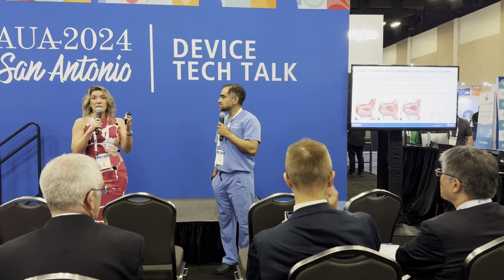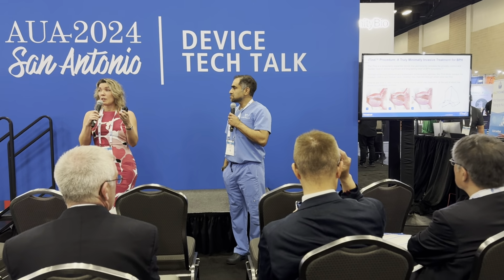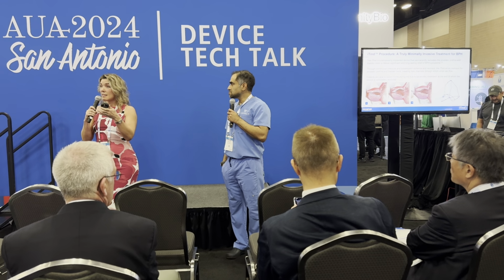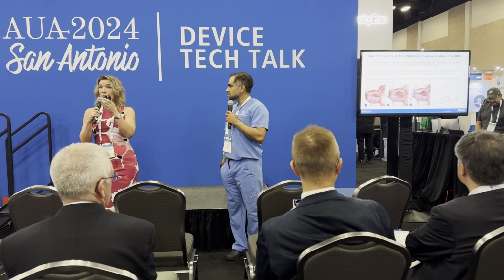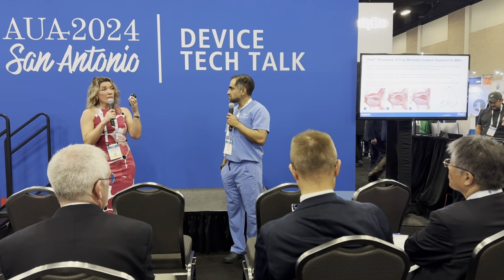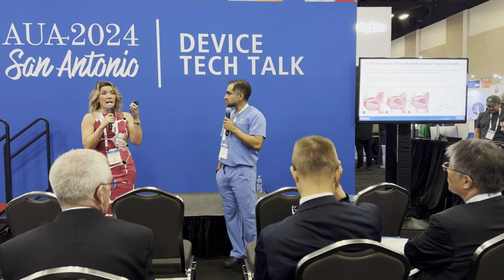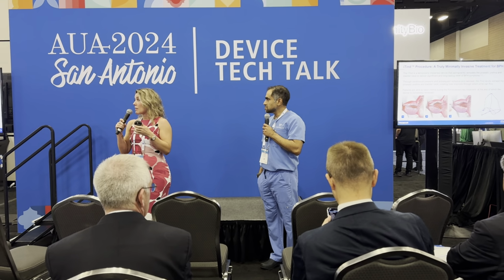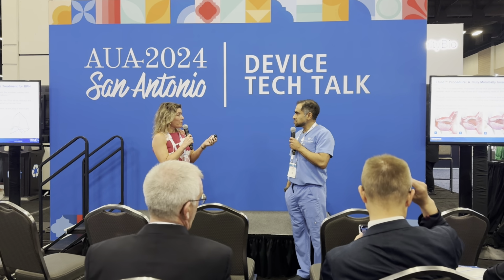It's implanted into the prostatic urethra in a crimped configuration and left there for only 5 to 7 days. Over that period, it slowly expands and exerts pressure at 3 points, at 12, 5, and 7 o'clock. Gradually, that expansion and pressure induces ischemic incisions and creates deep, longitudinal grooves at the bladder neck and the prostatic urethra, which is also unique to this procedure. It's the only minimally invasive procedure that treats patients with bladder neck obstruction as well as BPH.